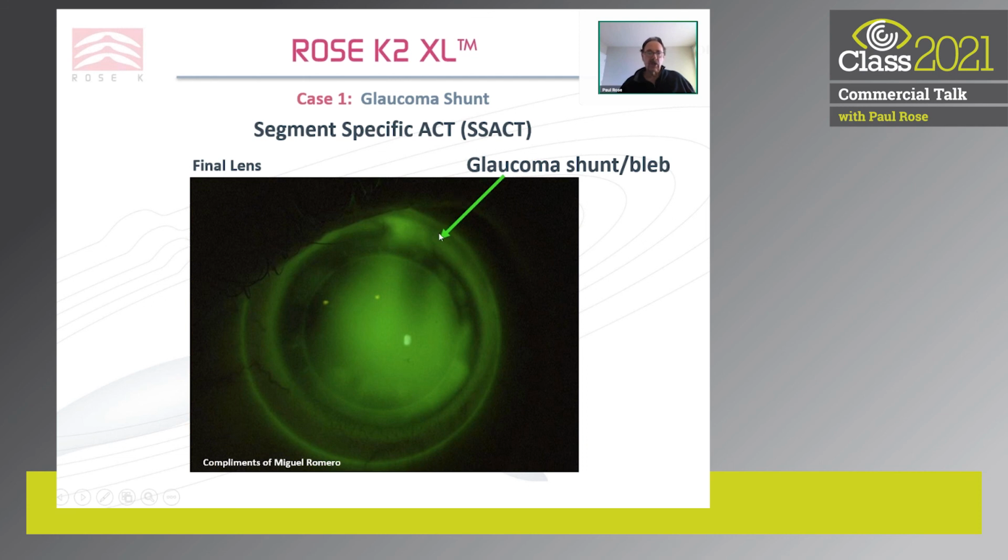We've got good drainage here, and this patient now wears this lens 8 hours a day. He probably could wear it more, but the practitioner wants to be conservative. It's a graft that's failed before. We don't want to put any extra problems or deprivation of oxygen with this graft.